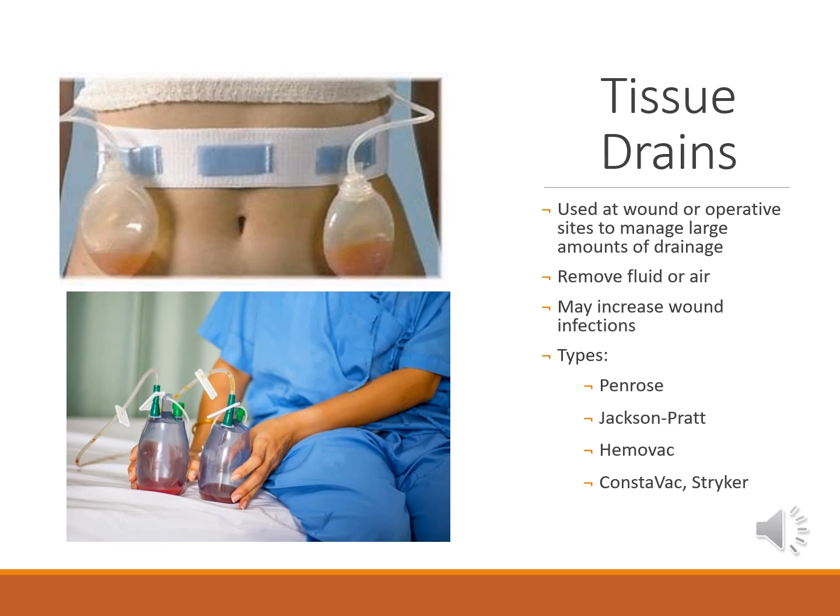after uncomplicated surgeries like total joint replacements. Research suggests that drains after laparoscopic procedures may increase wound infection rates and delay hospital discharge. During patient assessment, it's crucial to identify all drains and ensure no tension is applied that could dislodge them. Infection control is also important, as tissue drains create an opening that can easily become infected.